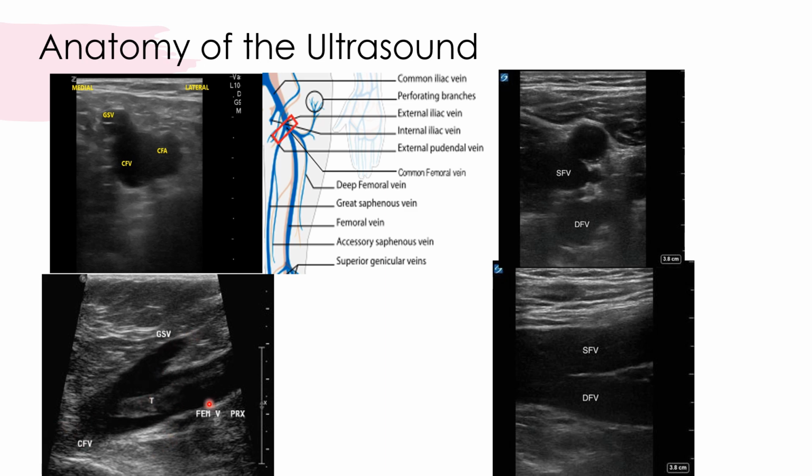In this long view, you can see that there is actually a very loose clot in this region. So this would be at high risk of embolization, because you see how it is free flowing from the wall. So with this, you'd have your answer right there, right at the first few images.